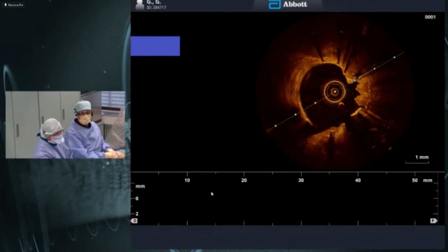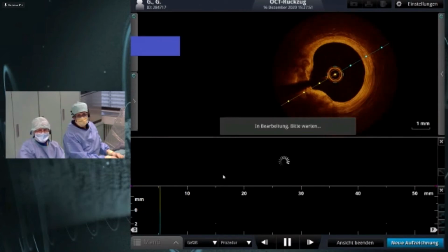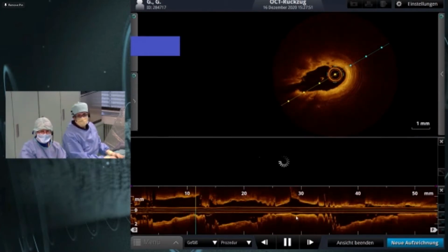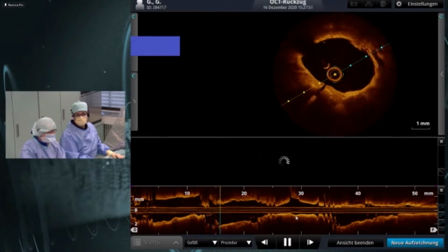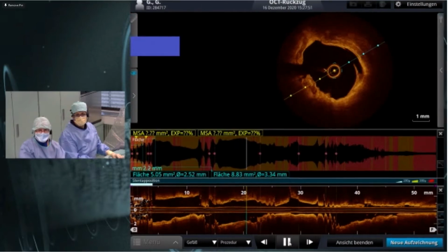What we want to see here, maybe we can see the entrance of shockwave energy to the segments, there's some disruption especially in the proximal part. Yeah, you can see nicely at 12 o'clock, 8 o'clock here.